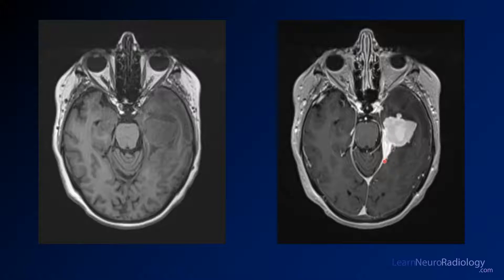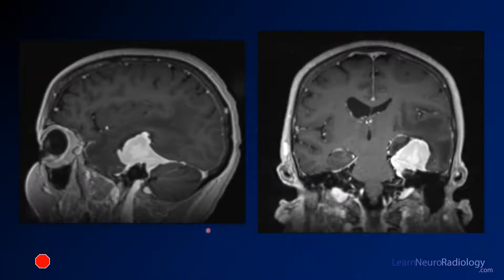This is a classic finding for an extra-axial mass called a dural tail, which leads you to believe this is probably a meningioma — although it can often be difficult to distinguish whether a mass is extra-axial or intra-axial. Additional post-contrast T1 images show involvement of the tentorium, extension along the petrous portion of the temporal bone, and significant displacement and edema of the temporal lobe. Asymmetry of the lateral ventricles confirms significant mass effect.